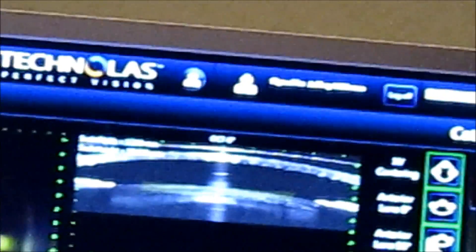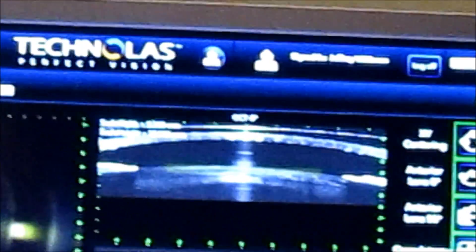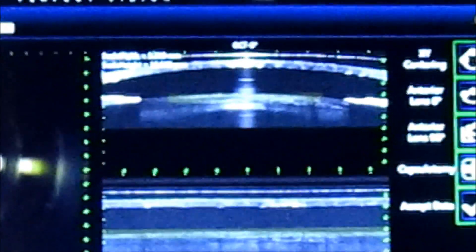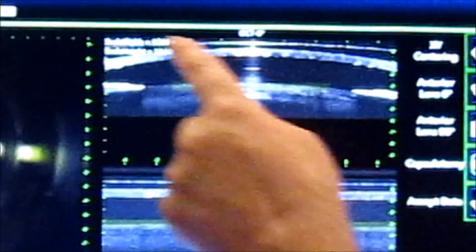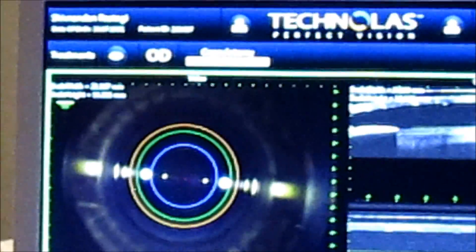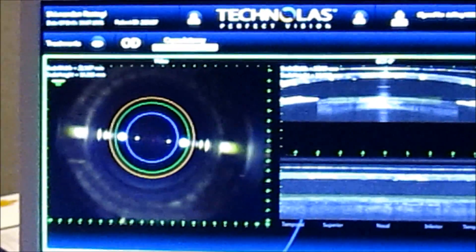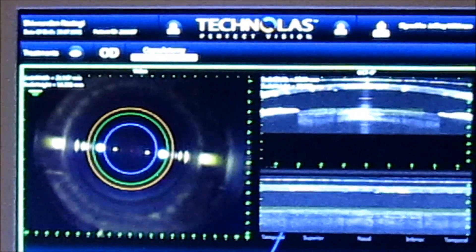Once that's set, we'll go ahead and store the information in the computer. Once that is done, the computer will tell us to start and will display a bar that says 'executing.' That's when I hit the foot pedal, and you'll hear some sharp beeping from the computer as the capsulotomy is actually made.